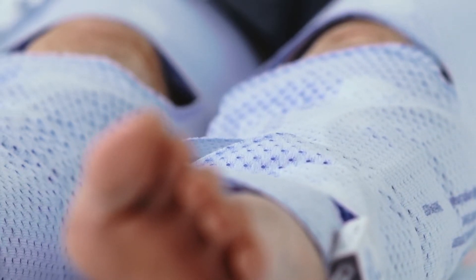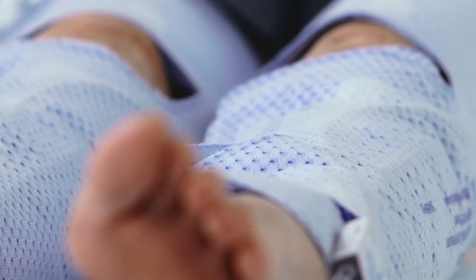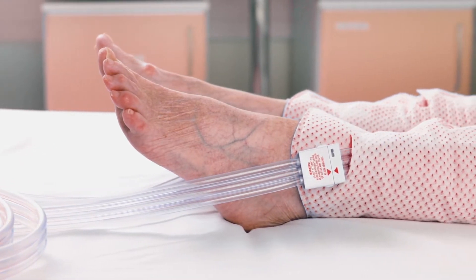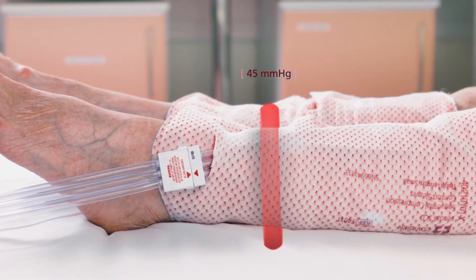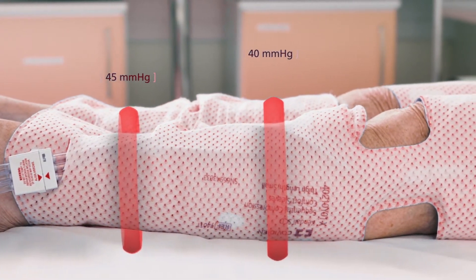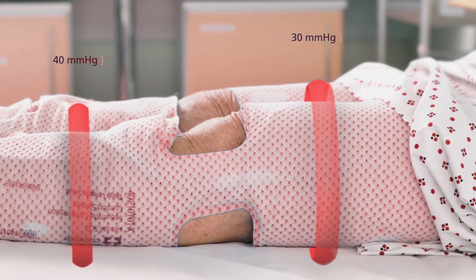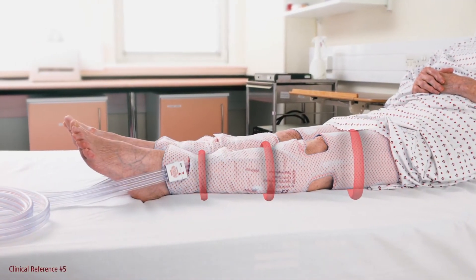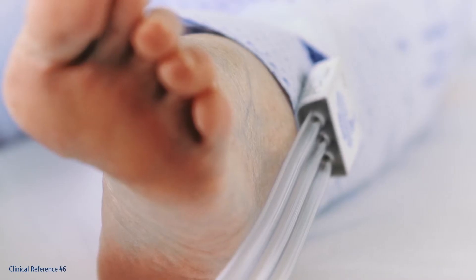The sleeves also compress alternately, one leg at a time, to mimic the action and hemodynamic benefits of walking. Each sleeve has three separate bladders which inflate sequentially: beginning at the ankle with 45 mmHg, moving up to the calf at 40 mmHg, and ending at the thigh with 30 mmHg. This maximizes femoral blood flow velocity, promotes unidirectional blood flow, and reduces the risk of blood becoming trapped distally.